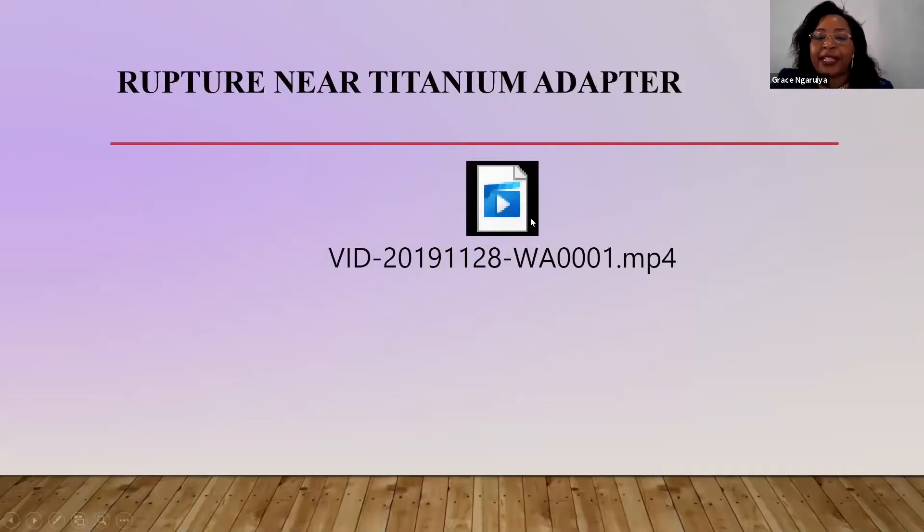For the other patients, because the catheter was not so close to the exit site, I wanted to show you how it was.